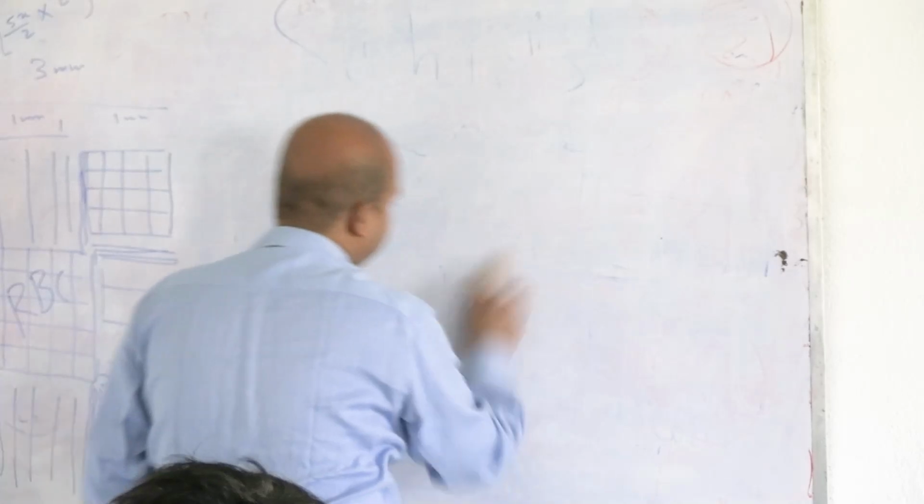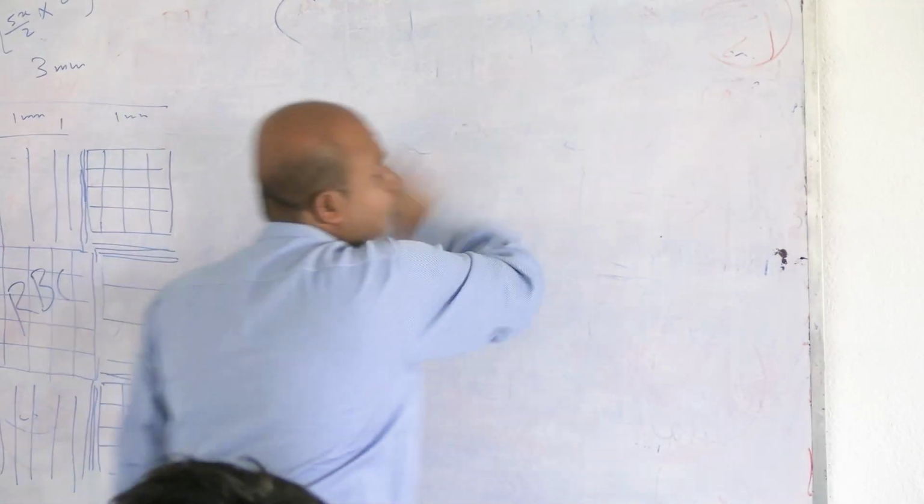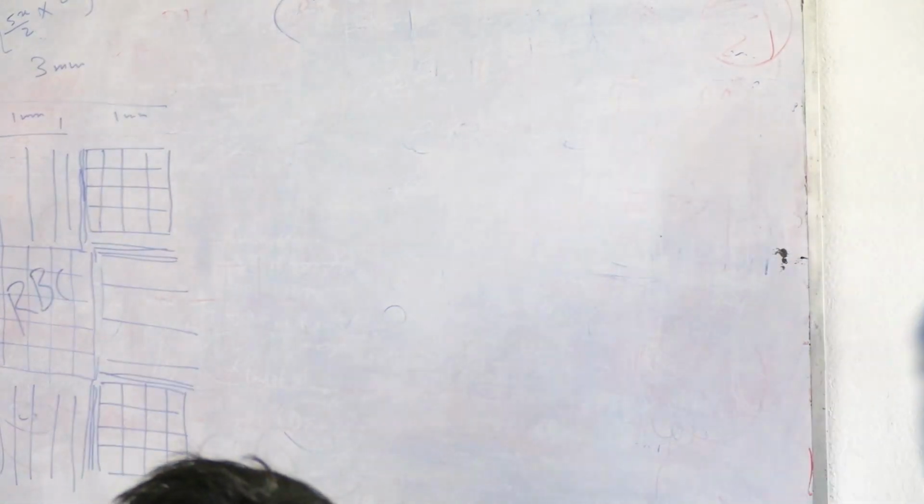Blood grouping, I think you already have the basic idea. How do we classify blood groups? Strictly speaking, blood grouping is, say you speak about the ABO system. Who discovered it, or who first described the ABO system?